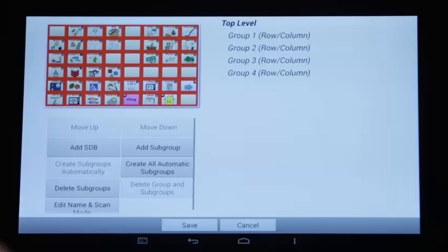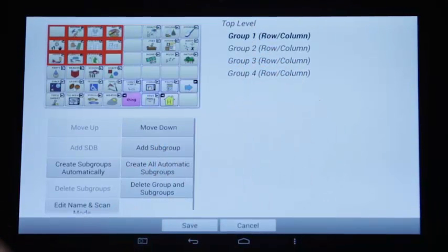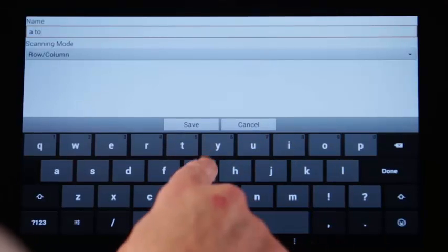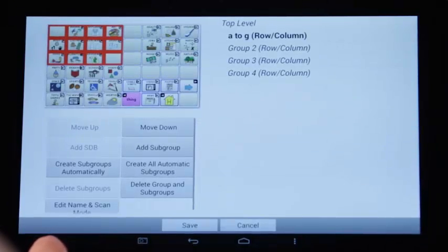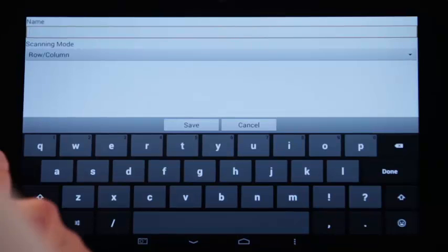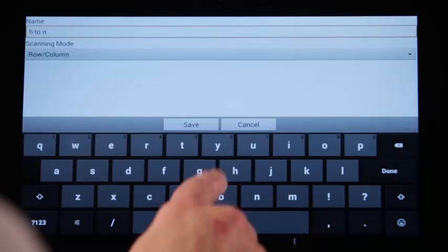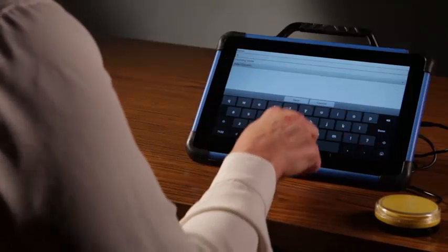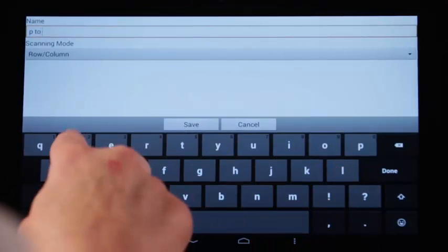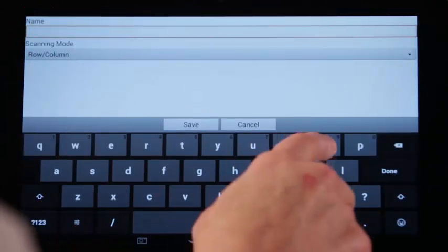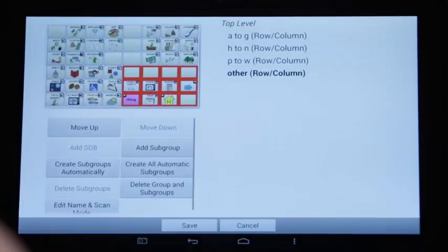Four groups are created. Each group can be renamed to create a meaningful label, which will be the auditory prompt. Tap Group 1, tap Edit Name and Scan Mode, type A to G, tap Save. Tap Group 2, tap Edit Name and Scan Mode, type H to N. Tap Group 3, tap Edit Name and Scan Mode, type P to W, and Save. Tap Group 4, Edit Name, type Other, tap Save. Tap Save again.